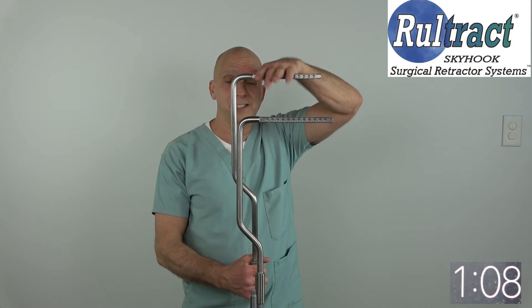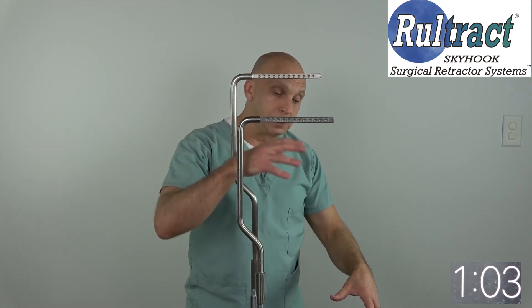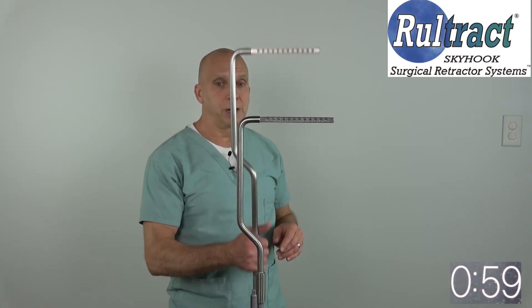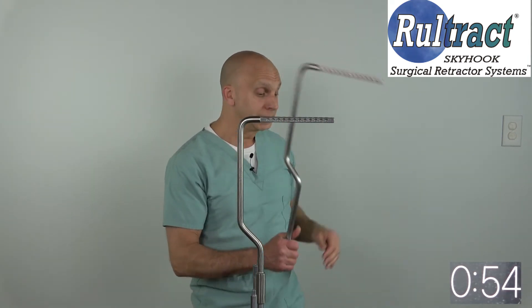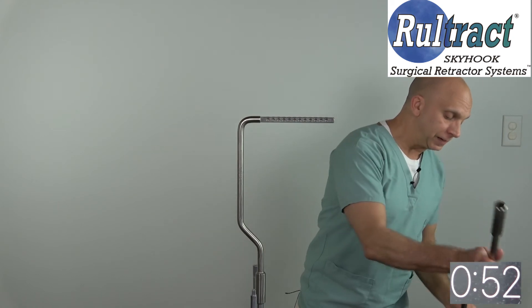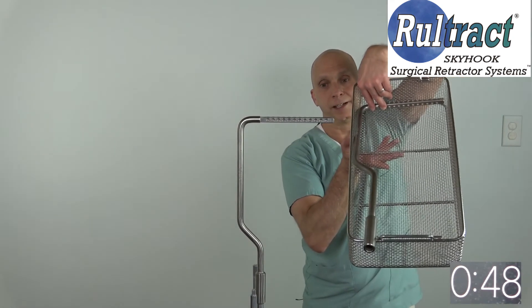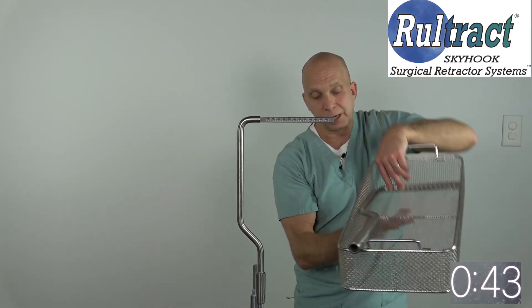If you have the extended length top post, you're kind of stuck at that height. So if you have a smaller patient, you might have too much height for a very small chest. The other problem with the extended length top post is that it does not fit in the standard size tray that all of your other Roletract equipment is probably in — you can see it sticking out. It has to be wrapped separately and brought into the room as a separate item, which could be a problem.